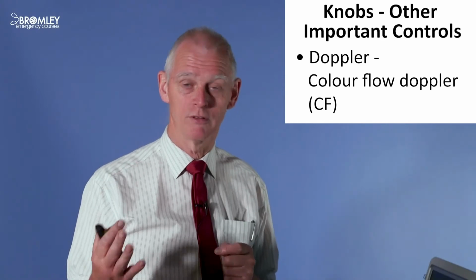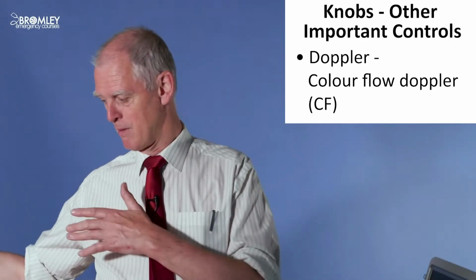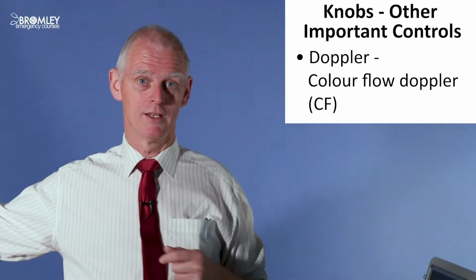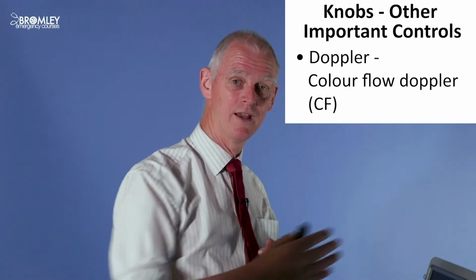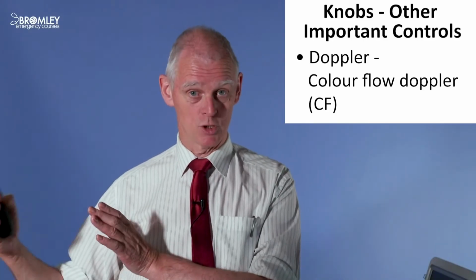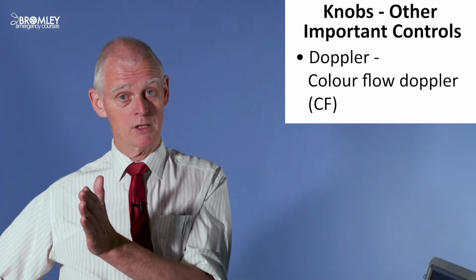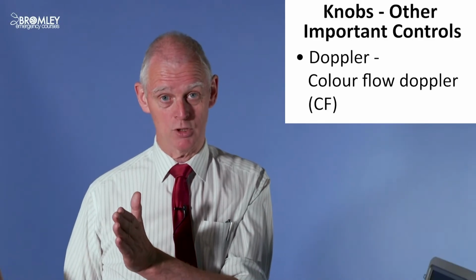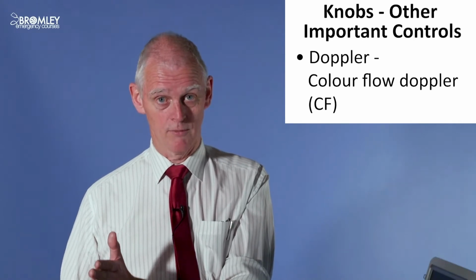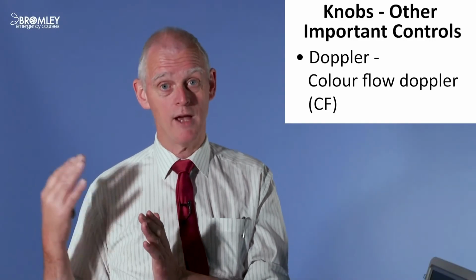If you think back to your physics at school, the Doppler phenomenon. You remember if you're standing by the side of a road and a car goes past you, it goes meow as it goes past, yeah? So as it's coming towards you, sound is leaving the engine, a sound wave, and as it leaves the engine, the beginning of the wave comes out, but by the time the end of the wave leaves, the engine has moved. So the wavelength becomes shorter. The wavelength is shorter, the frequency is higher. So this is why it sounds higher as it approaches you.